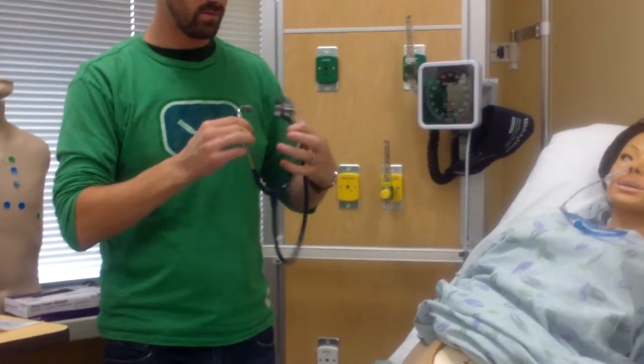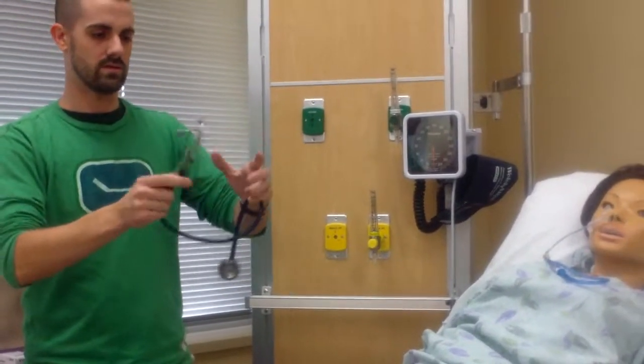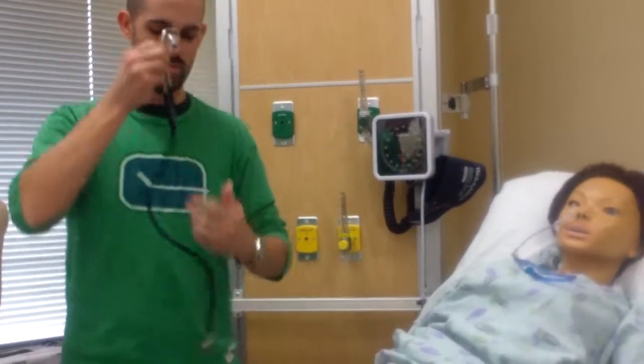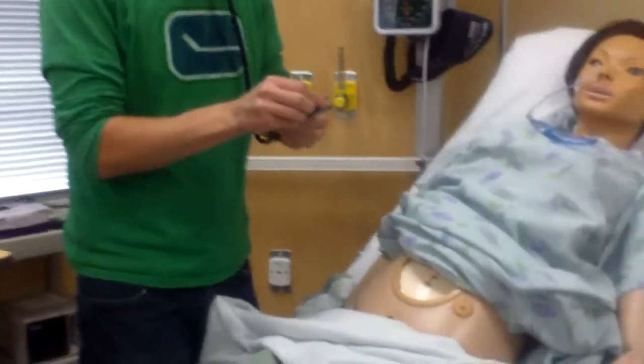Good. Okay. Just a little wet still. Okay. And then, I should have this right here.